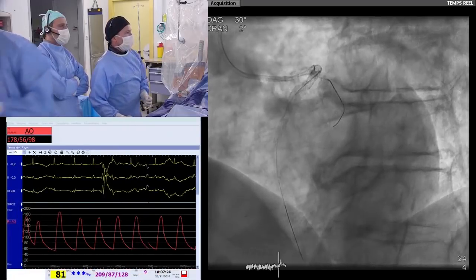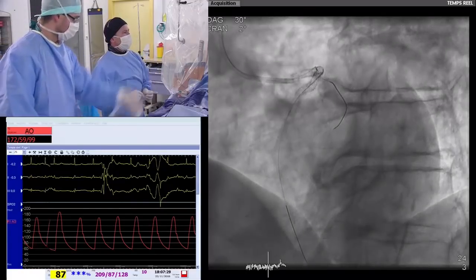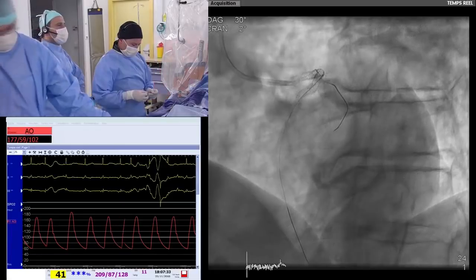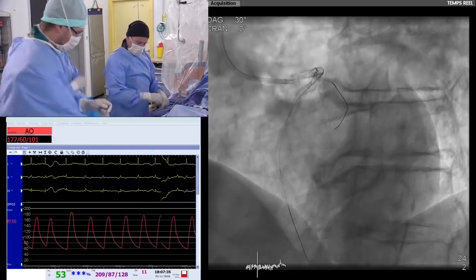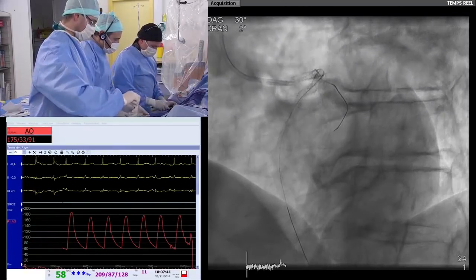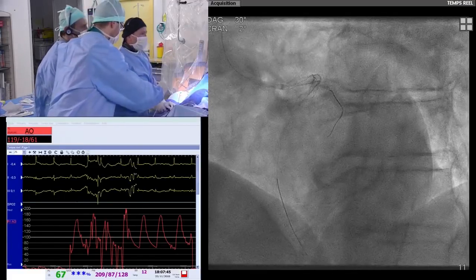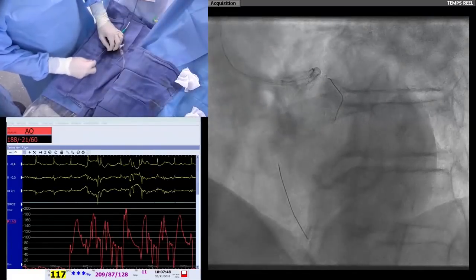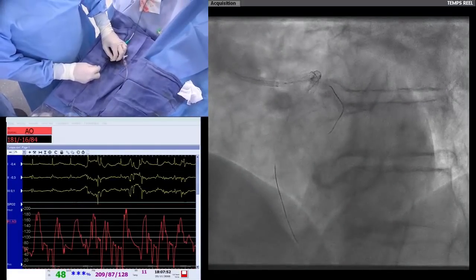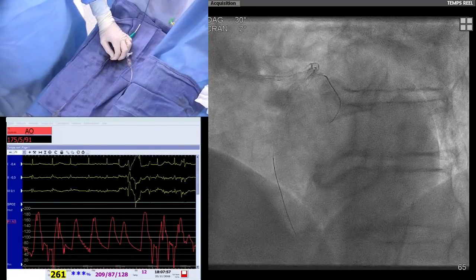Okay. I am coaxial with the stent, and I think there is no longitudinal compression. This is okay. So I will engage slowly a balloon inside the proximal LAD just before the diagonal to perform a proximal optimization, a post dilatation inside the stent between the ostial LAD and the diagonal. So now slowly I engage the balloon inside the left main and the LAD, and then I will change the view. 3.5 non-compliant balloon, Didier.